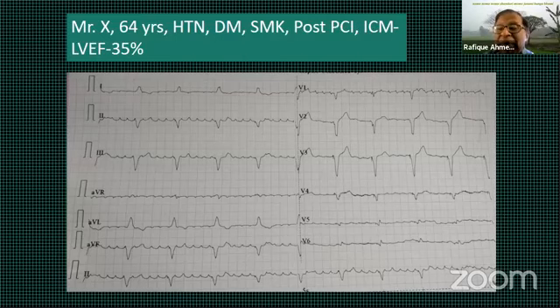Remember, this patient actually has a single coil ICD, and that's only in the RV. It is more effective when there is a dual coil, because the second coil sits next to the atrium, and the cardioversion works better. But I usually try one time through the device because the patient is under anesthesia. This may convert, and if it doesn't work, immediately switch to external cardioversion.